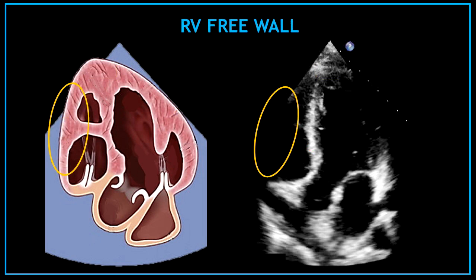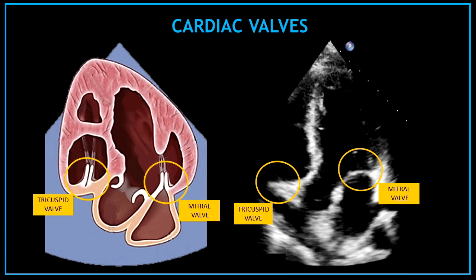Also, in this view, we can visualize the right ventricle free wall. Like in the apical 4 chamber view, we can also visualize here the tricuspid valve on the left hand side and the mitral valve on the right hand side of this view.